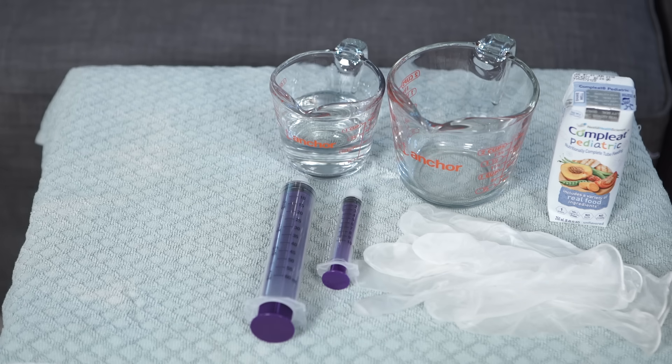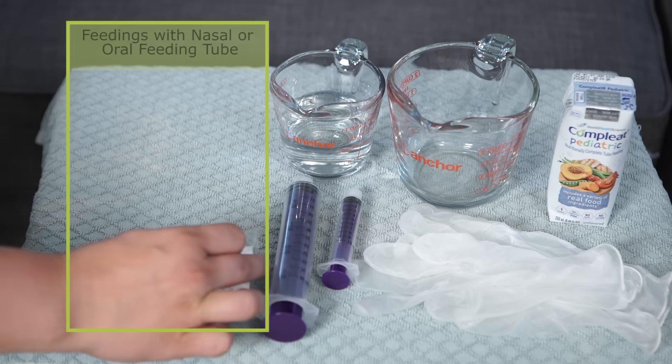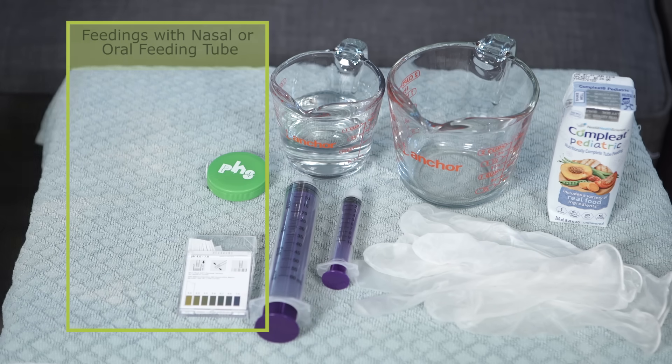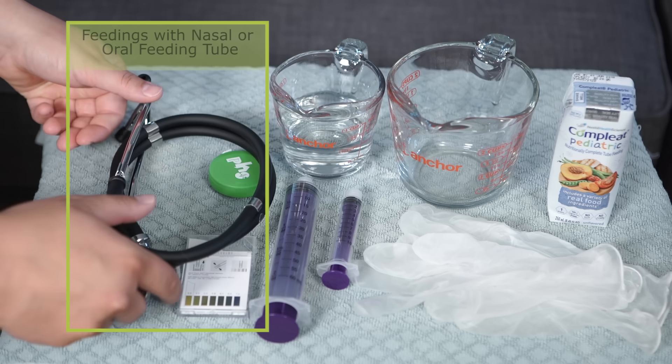For feedings through a nasal or oral feeding tube, you also need pH strips, measuring tape, and a stethoscope. You need these to check the tube placement.